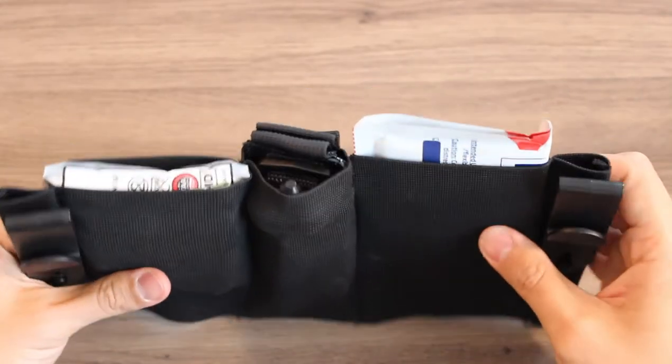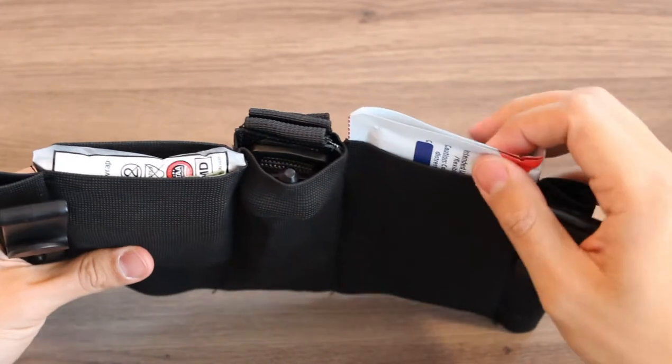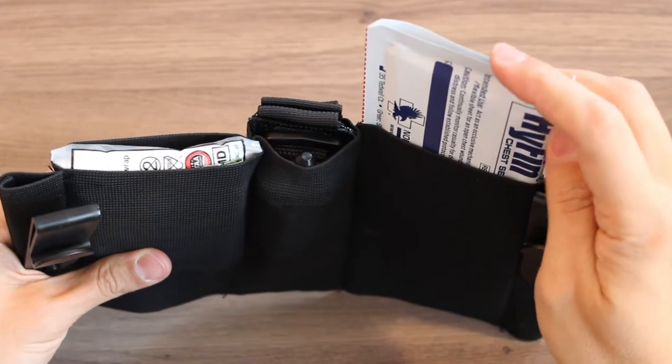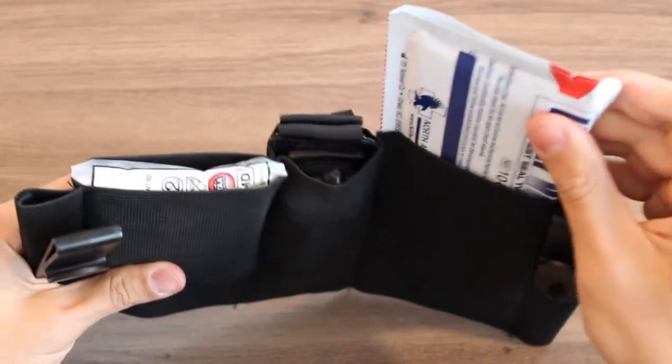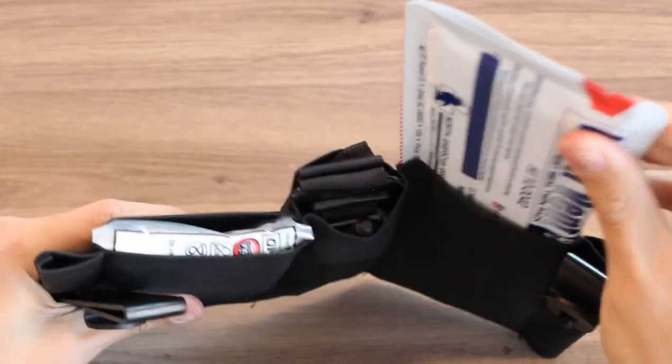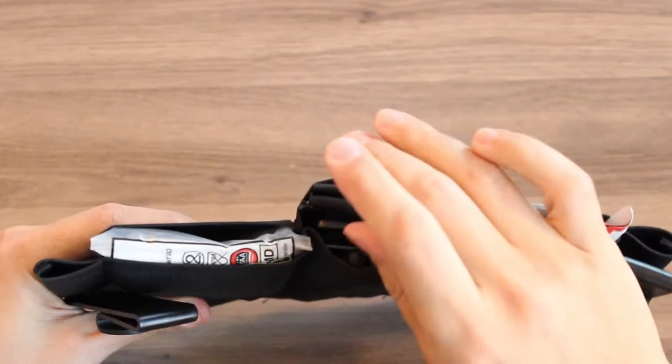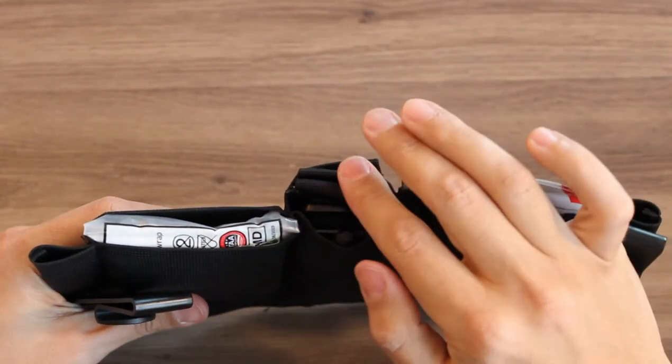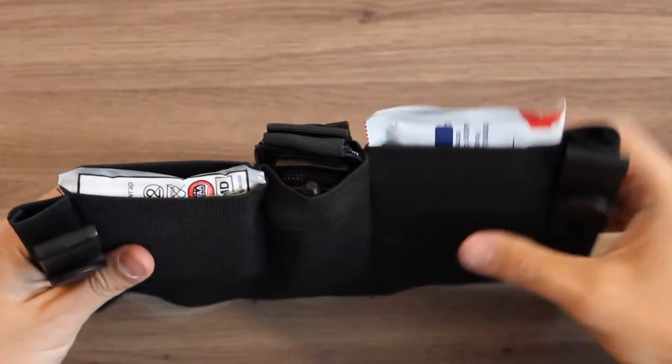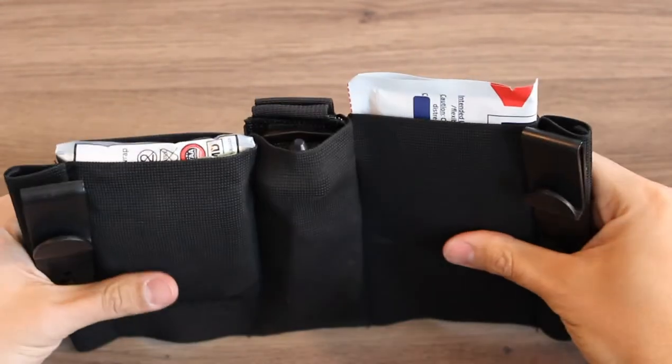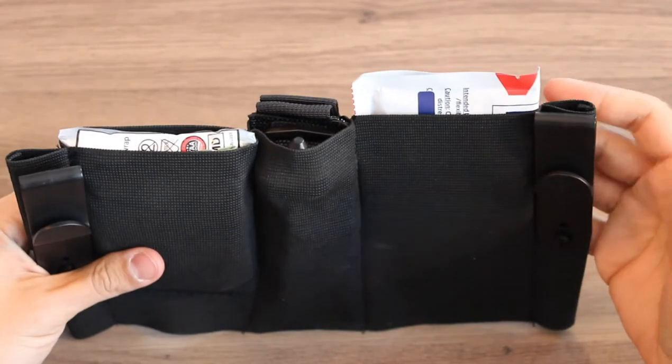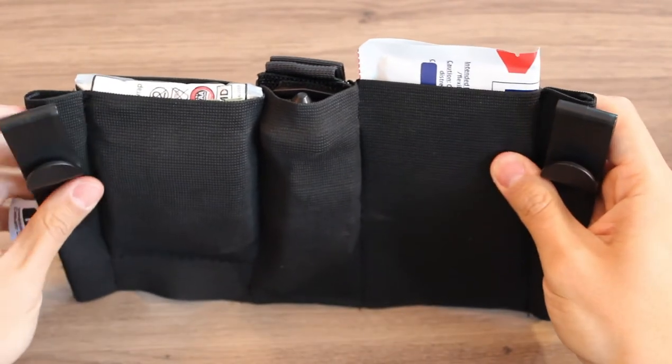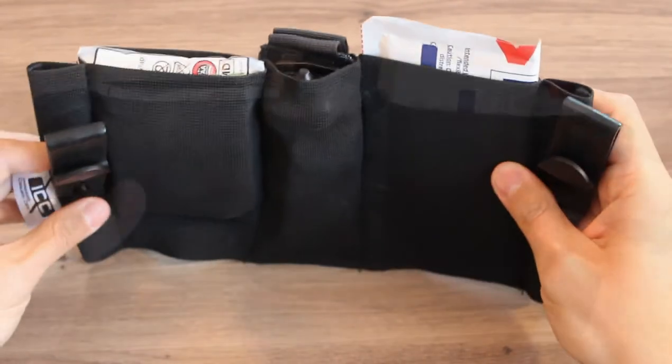Now we have it set up with two Hyphen chest seals as well as the Gen 4 Soft-T tourniquet. This will set off metal detectors and wands.